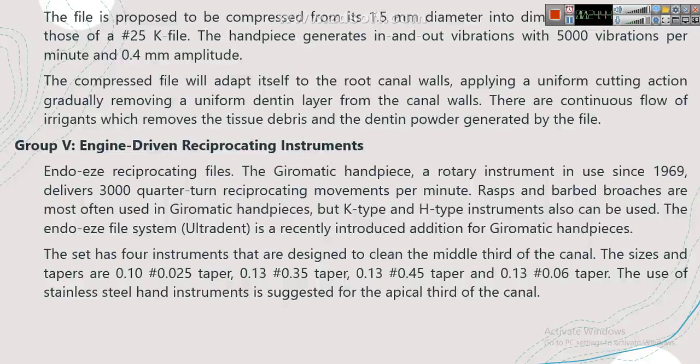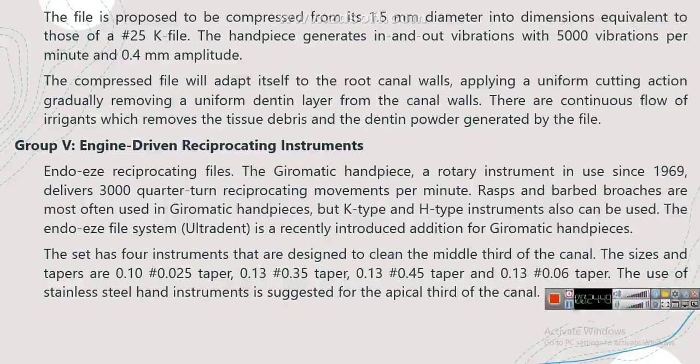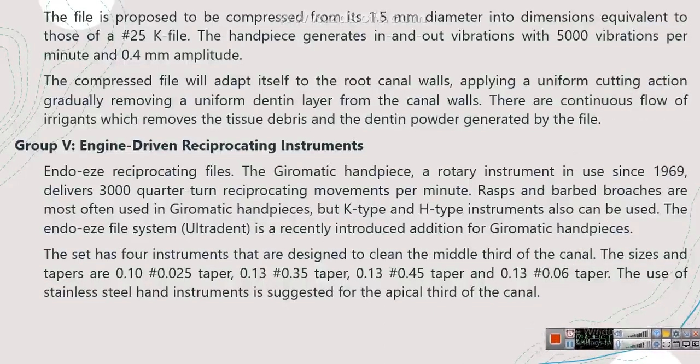The file is designed to be compressed from its 1.5 millimeter diameter to the dimensions equivalent to those of a number 25 K file.